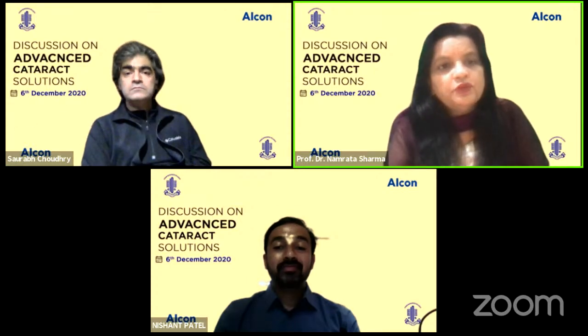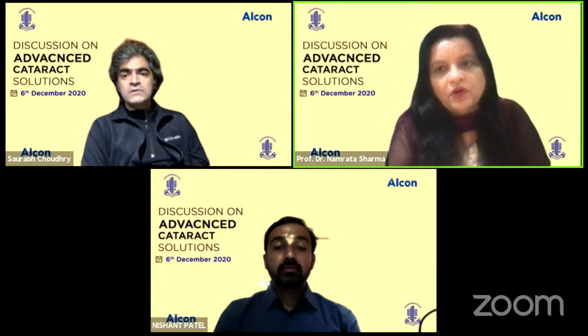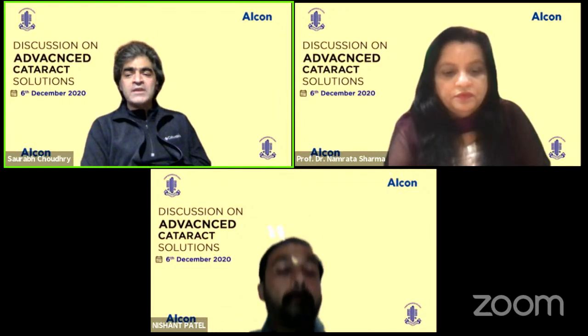Another question for you, Saurabh, is that if that soft plastic drops in the chamber while working, has it ever happened, or is there a possibility of it? I have actually used that tip only in 3 of my OTs, and I put it through the ETO. In the third OT, I thought the efficacy had slightly gone down. After my third OT, I decided to examine the tip, and I broke the tip. In fact, I was trying to break it. It's not very easy to break, and I don't think it is going to break.